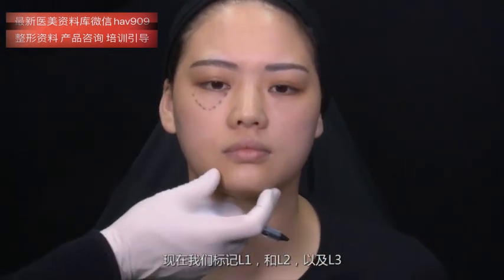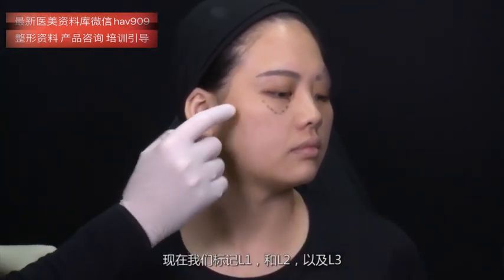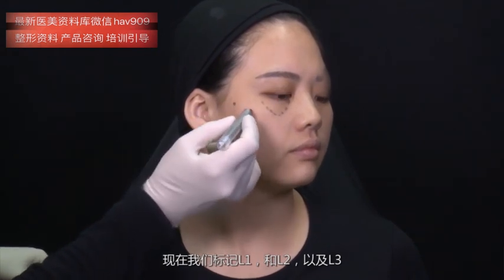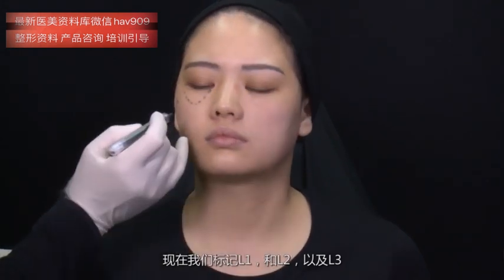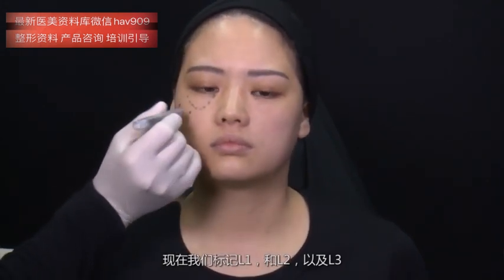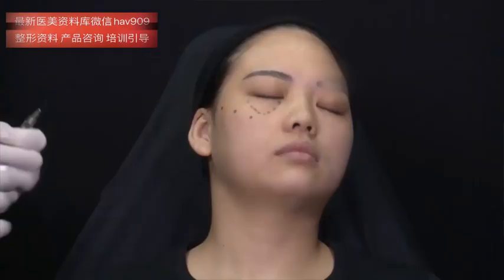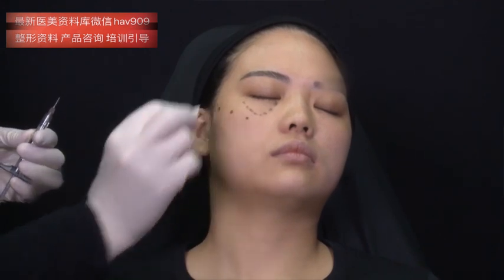So let's mark L1 and L2 and L3. Now let's proceed to the injections.